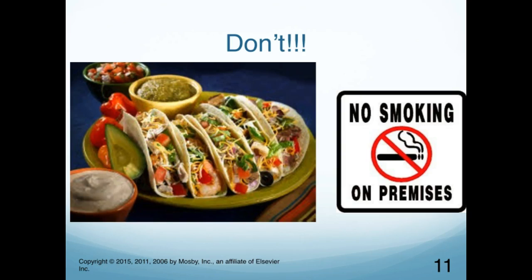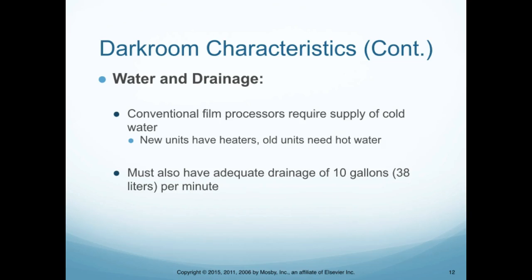Okay, so probably needless to say, you shouldn't be eating or smoking inside the darkroom. I can't really speak for anything before the 1980s, but it seemed like everybody was smoking then. No food, no smoke. I don't think you can smoke in any hospitals anymore.